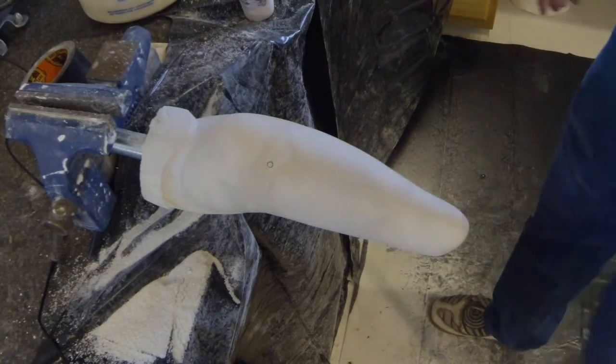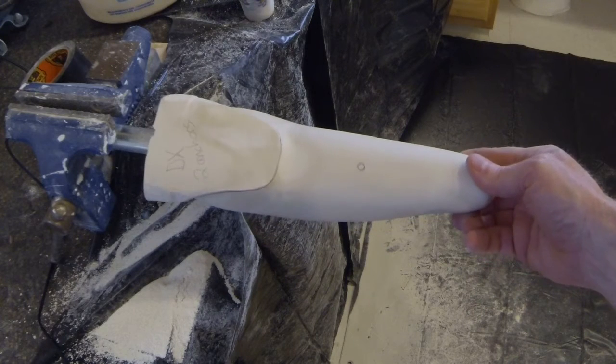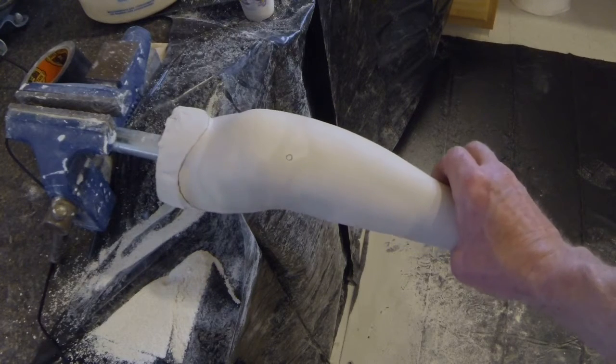For thermoplastic sockets, in addition to the buildup distal to the antecubital fold, a buildup is required on the proximal aspect of the olecranon as well, in order to accommodate the progressive prominence of the olecranon as the elbow flexes. The location of the buildup is shown here.